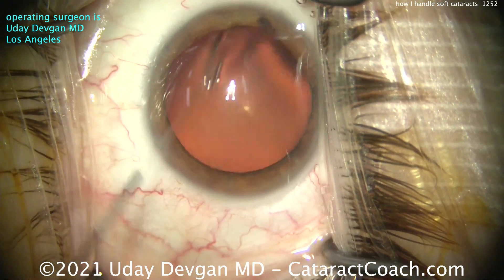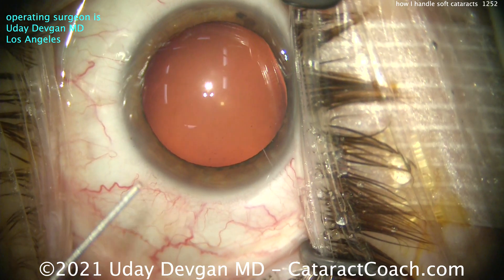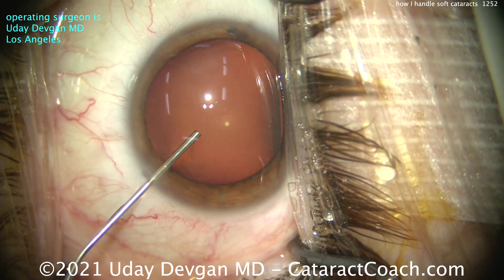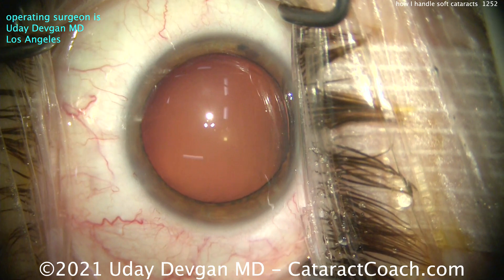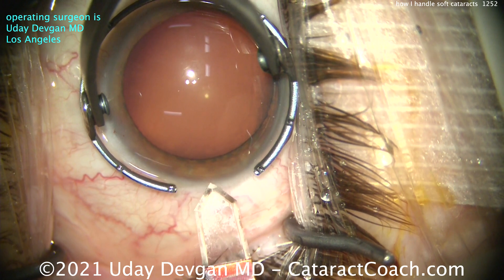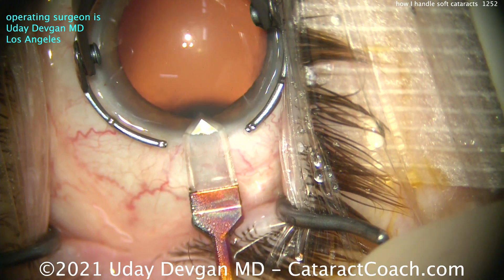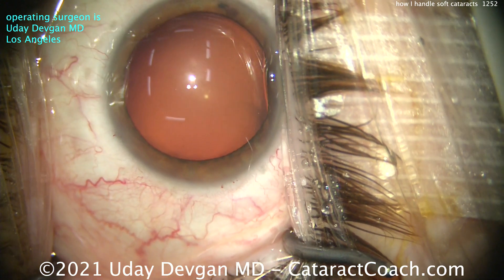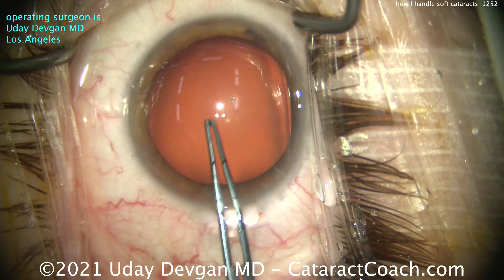This is a patient who has a cataract. You're thinking where's the cataract? But it's really there — the red reflex here is washing it out. The patient is on the young side; it's the patient's second eye. Patient's also a high hyperope, so we're going to be able to treat that hyperopia at once as well. You can tell the patient's young because of the eyelashes, which are nicely sequestered out of the way. Here's our main incision — definitely want a good incision there. This has to last this patient's lifetime. Younger patients tend to be the ones who have these soft cataracts.